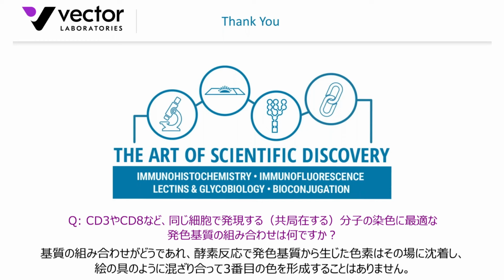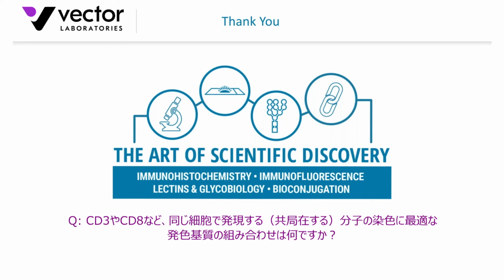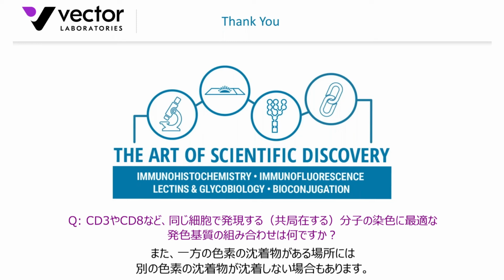It's not like mixing wet paint where you're going to reliably generate a third color when they mix. They just don't operate like that. They've got unusual reaction kinetics and the way they do precipitate out. Indeed, some of them don't like precipitating on top of each other. And if one is already present, the other one might not precipitate there.